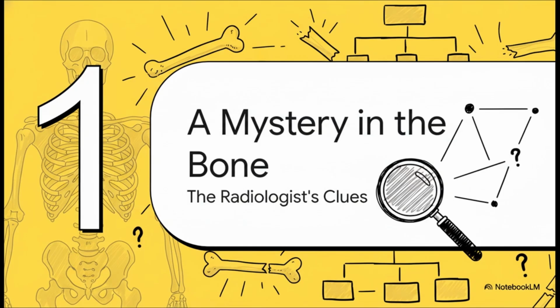Well, our lead detective in this whole story is the radiologist, and their number one tool, the most important piece of evidence, is the plain radiograph. Yep, the classic X-ray. You know, long before all the super fancy, high-tech scans, this simple image held all the keys. And as you're about to see, it's still the most powerful first step in the entire investigation.